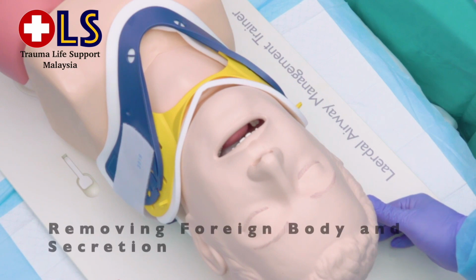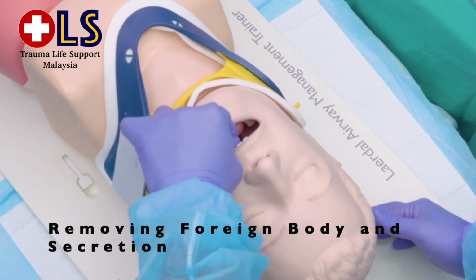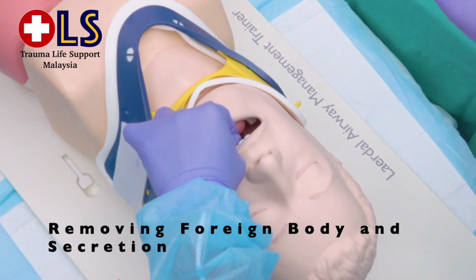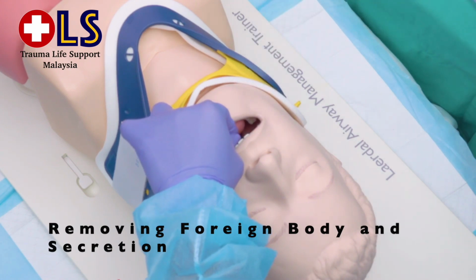Removing a foreign body with a Magill Forceps. First, we need to open the mouth. Visualize and see whether there's any foreign body seen. Oh yes, there's a foreign body. Magill Forceps. Remove your foreign body.